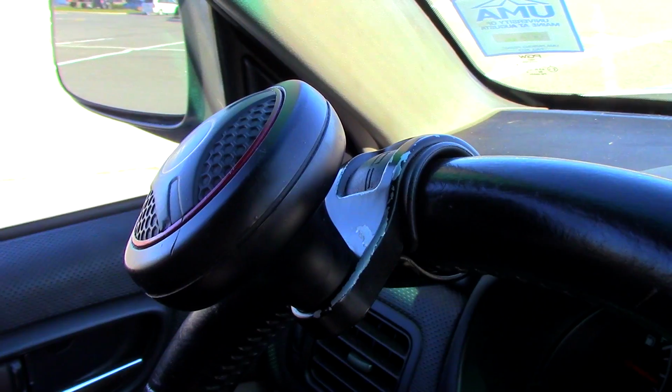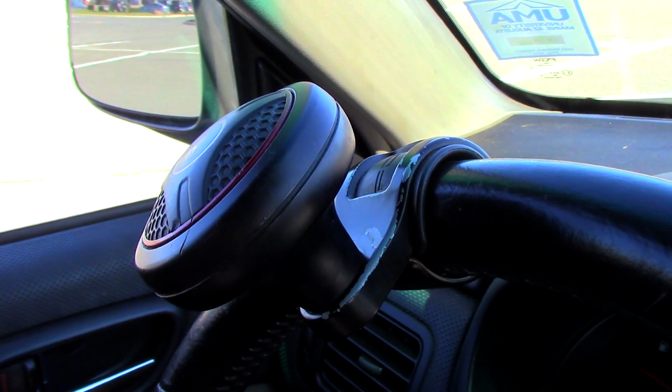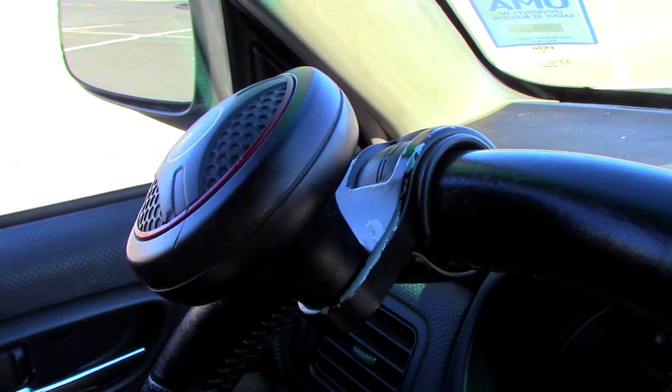Like I said, we did this ourselves. We just bought the knob directly from Amazon. But if you are doing this properly through therapy, they should definitely be able to attach it for you or direct you to the place that can. And again, this is my only knob that I've ever had, so I'm not quite sure how much the other brands differ from this one.